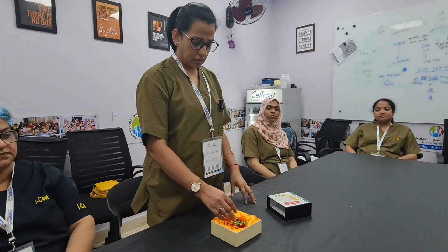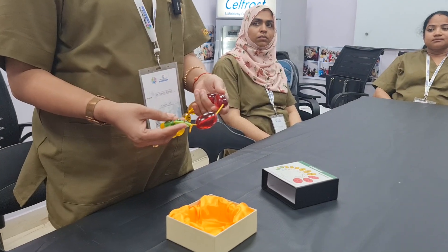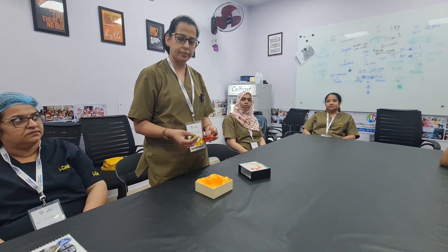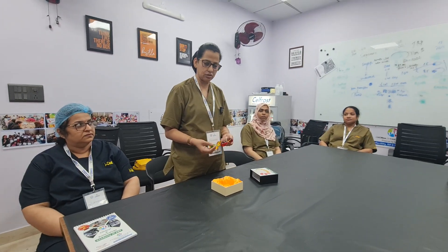Hello everyone, I am Dr. Supriya. Today I will be talking about Prader's Orchidometer. It looks somewhat like a rosary bead. It was devised by Dr. Adolf Prader in 1960 at Zurich University.